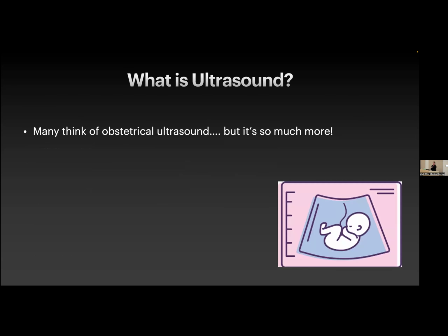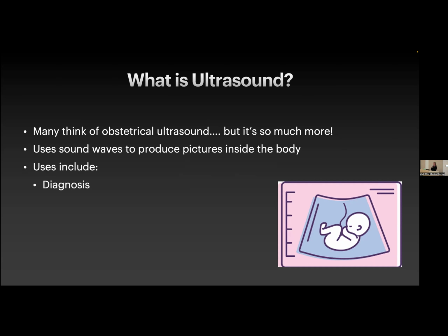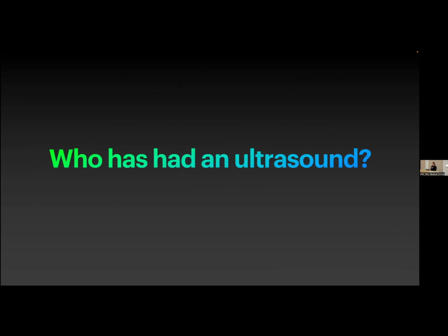I know a lot of what's in movies and on TV, you think ultrasound, or maybe personally, if you've had an ultrasound, you might think, okay, well, it's obstetrical ultrasound or ultrasound of a baby when in a pregnancy, but it really is so much more. We are using sound waves to produce pictures inside the body, and we can use it for things like diagnosing disease. We can use it for guiding us when we're doing procedures. We can also use it for therapeutic interventions. And I'll talk a little bit about that as we go into the emerging uses of ultrasound.